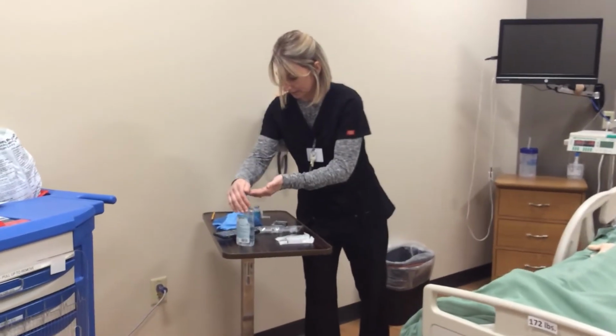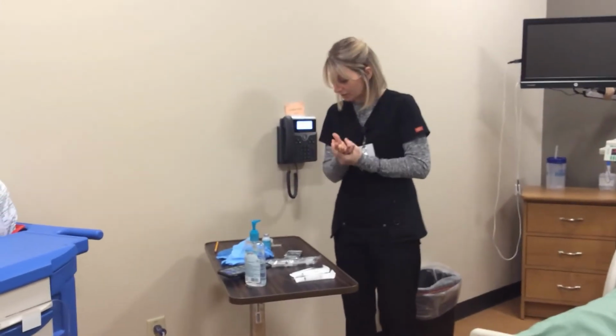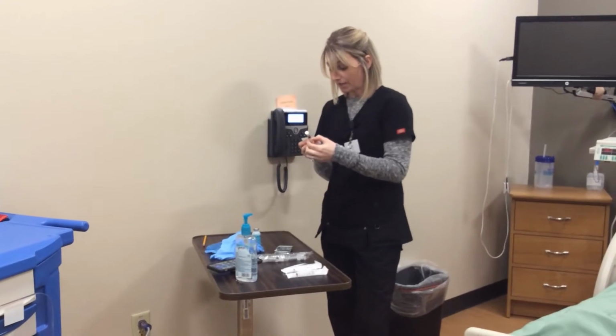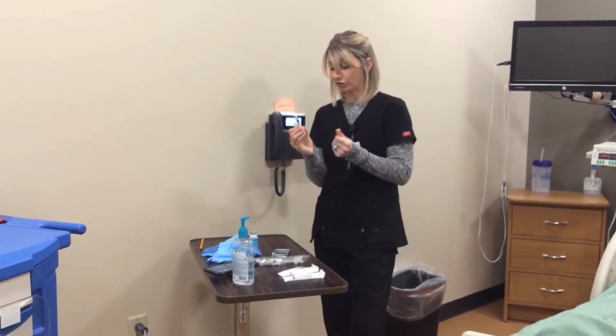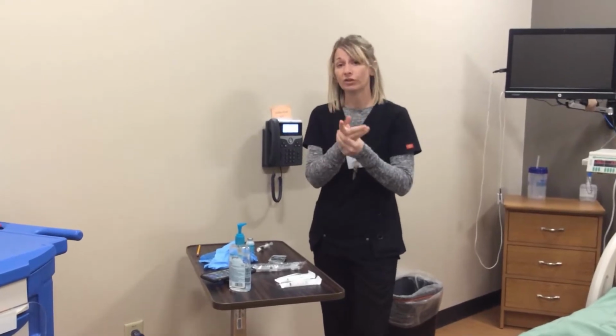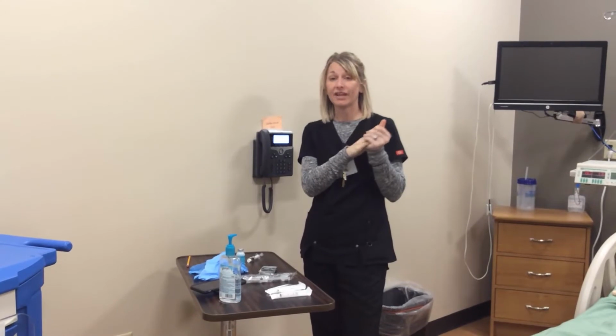All right, I'm going to perform hand hygiene. I pulled my medications from the Pyxis. Right away, I note that the morphine that I pull is in a concentration of 4 milligrams per 1 ml. My dose from my doctor is 2 milligrams. So I do my med math, and I know that I'm only going to give half of an ml.